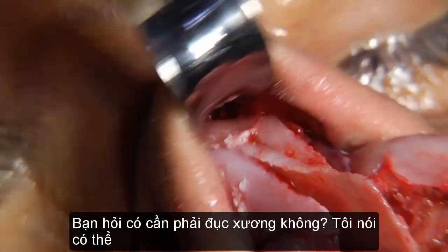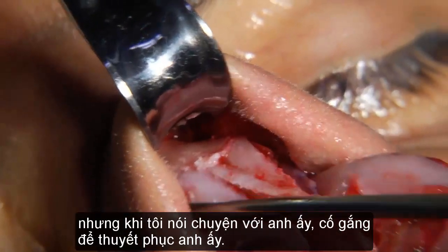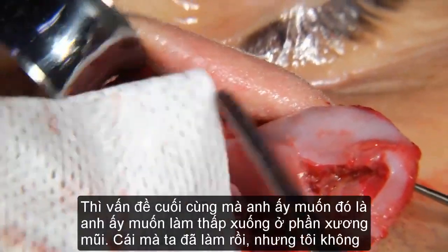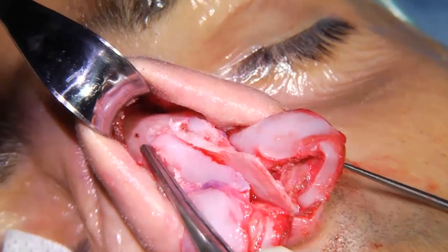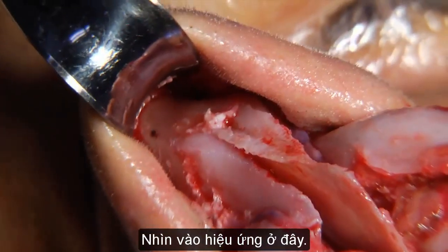Garifalia, if you're there, you told me, would he need osteotomies? I said maybe, but when I spoke to him, trying to convince him, the last issue he raised is that he liked his dimples on his bone, which I, of course, will reduce, but I don't really want to change that much. See the effect here? All I really need now is this area.